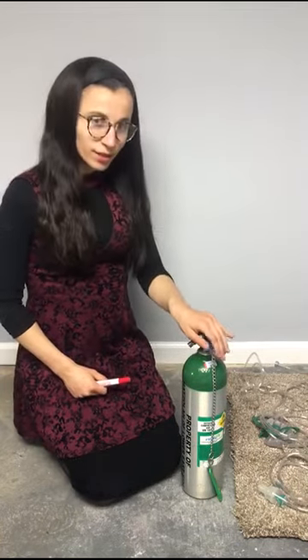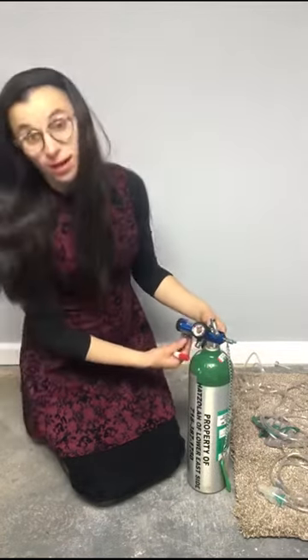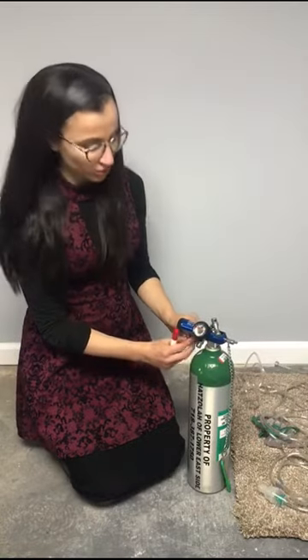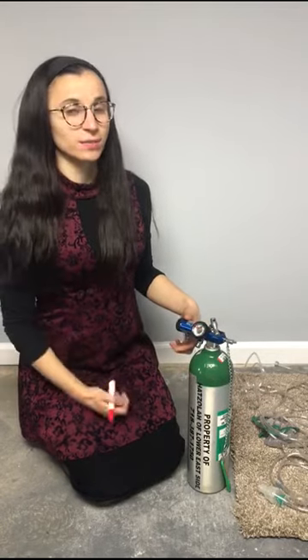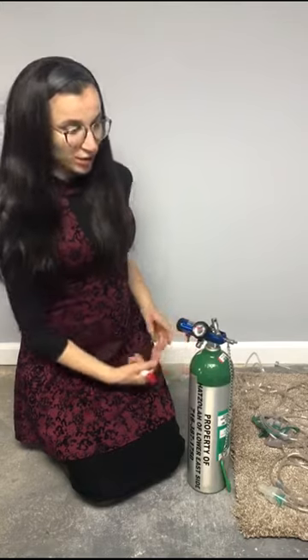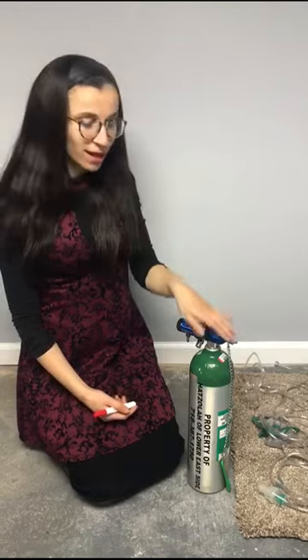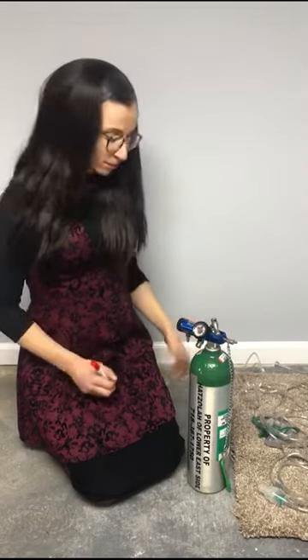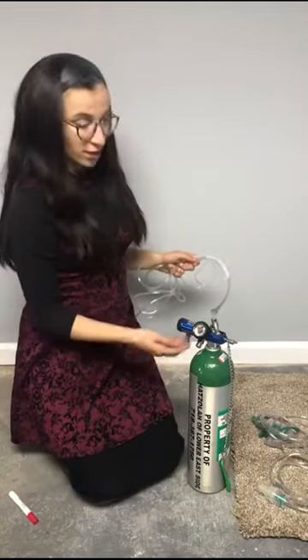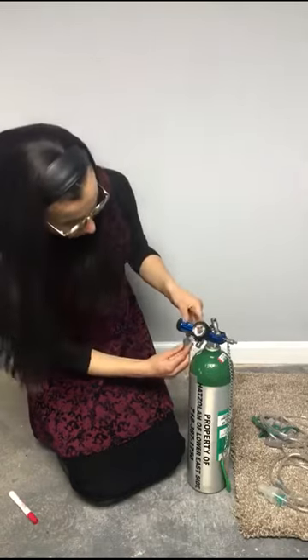So over here is an oxygen cylinder. Over here is what I like to call a tree, because it looks like a Christmas tree. And here is where the tubing connects to the patient. A lot of times you'll have the same tree, but it'll be connected to the wall, like in a hospital. You'll have this where they're transporting the patient, or EMS is bringing the patient, etc. So all your tubing is going to connect to the oxygen, whether it's the tree over there or over here, it's all going to connect. So this piece over here is going to connect to the oxygen.